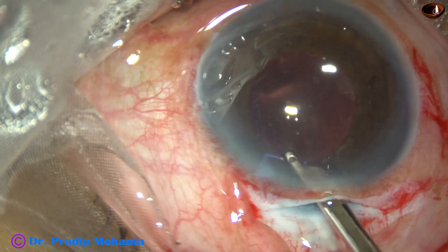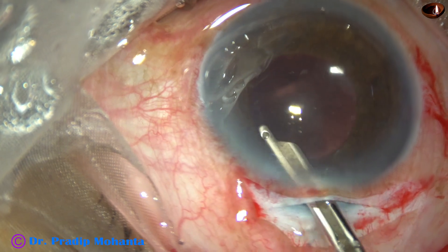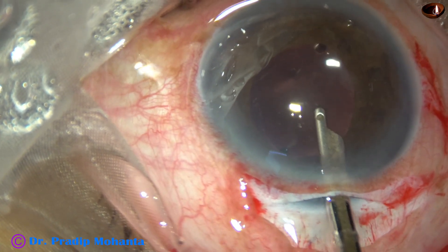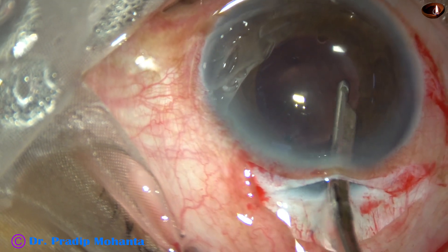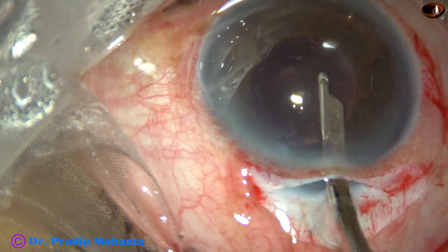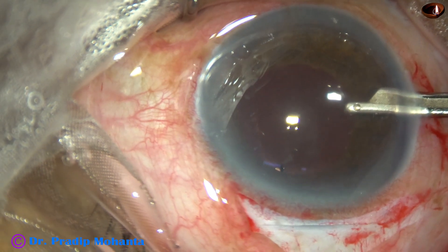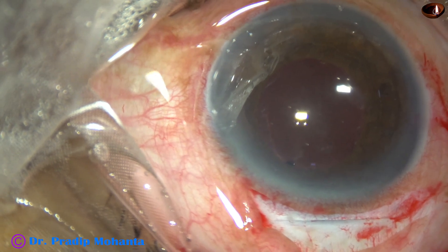Now the viscoelastic is nicely washed out of the capsular bag as well as from the anterior chamber. The case is almost done.